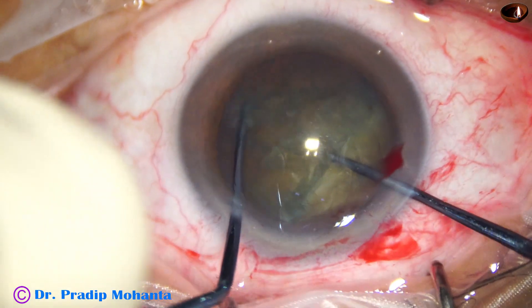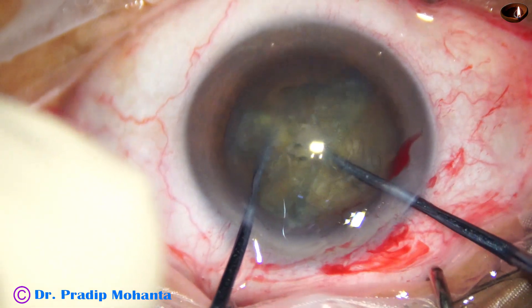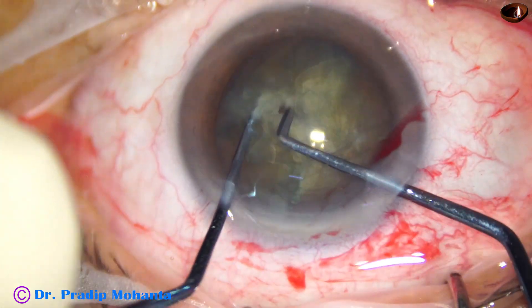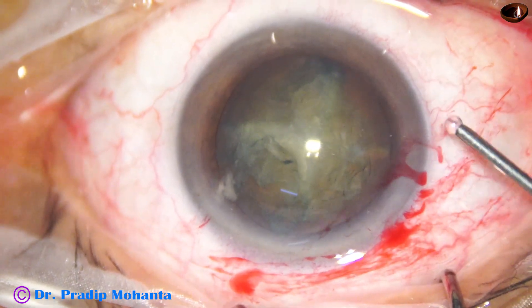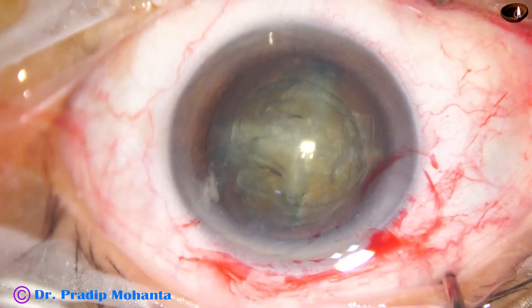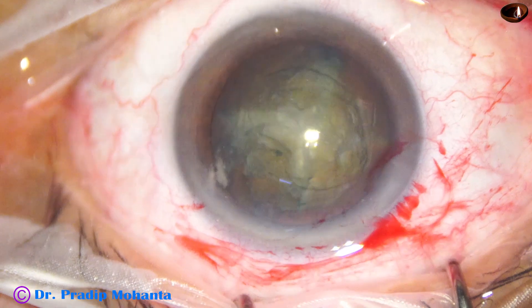The nucleus is rotated and then one hemi-nucleus is subdivided into two pieces. Now we can easily manage this nucleus using minimum ultrasonic energy.